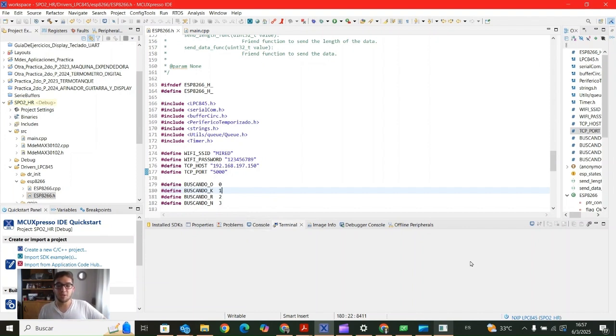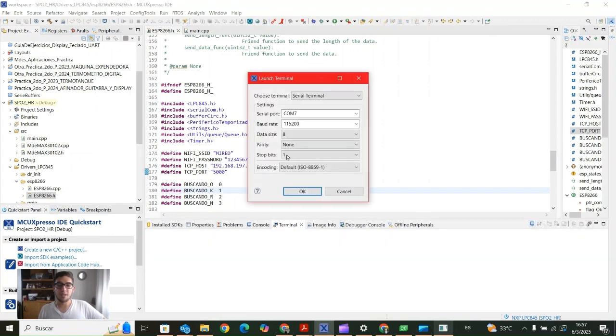We're going to open a terminal. These settings should be like this. Okay, the baud rate 115,200. It should be like this. The data size, parity none, stop bits one. Okay, these settings are designed because of the microcontroller. It should have these settings.